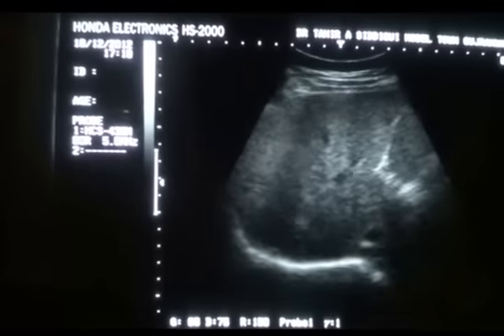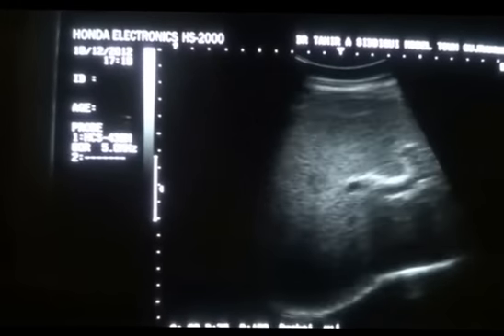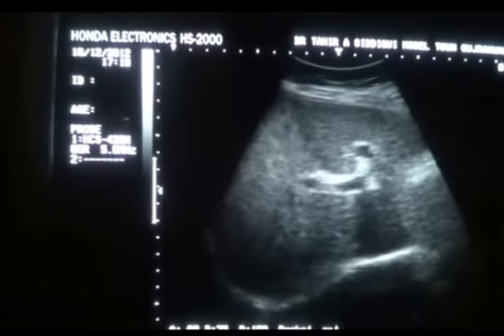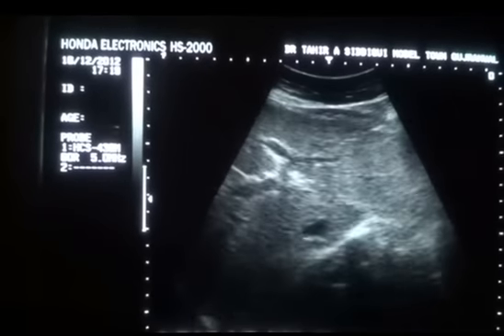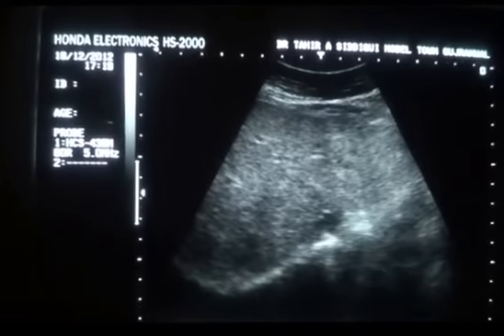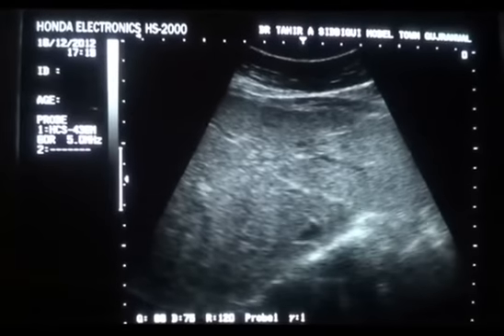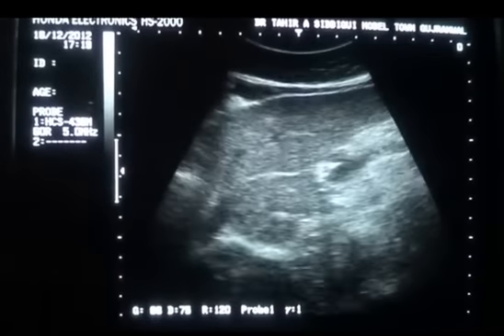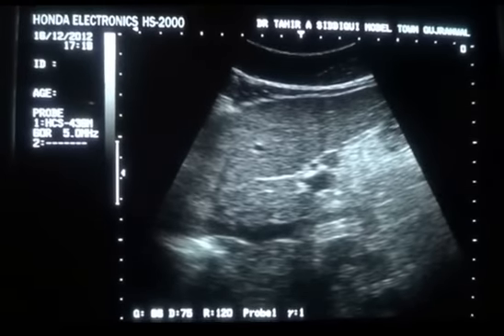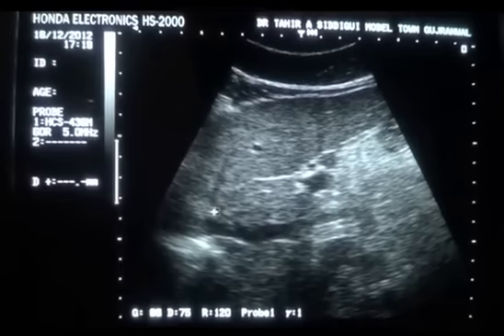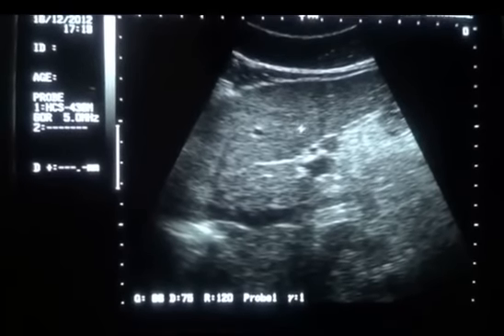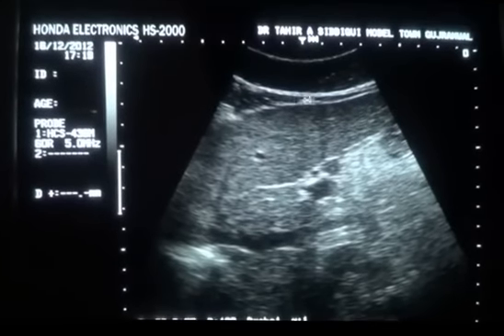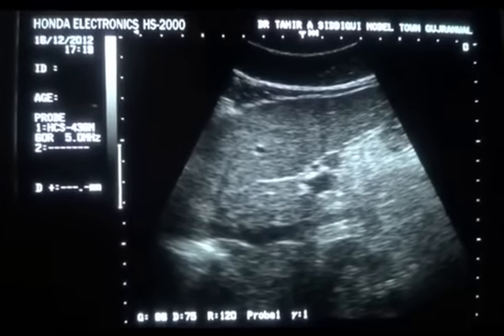I am giving a sweep below the costal margin with the face of the transducer towards the patient's right shoulder. You can see the coarseness. This is the caudate lobe of the liver, segment one. This is the longitudinal section of the left lobe with wavy outer surface.